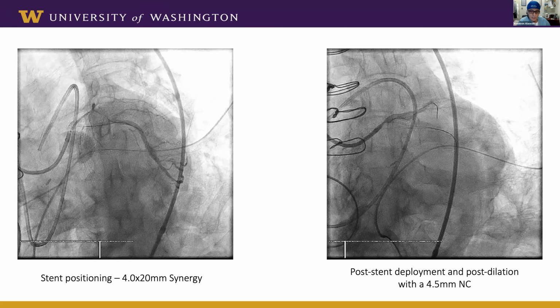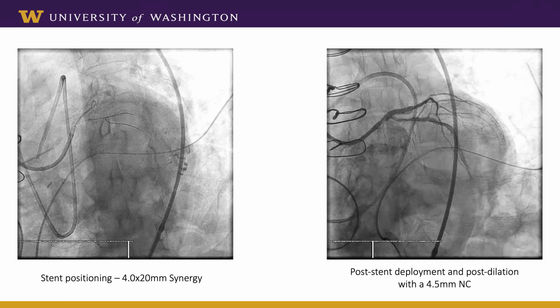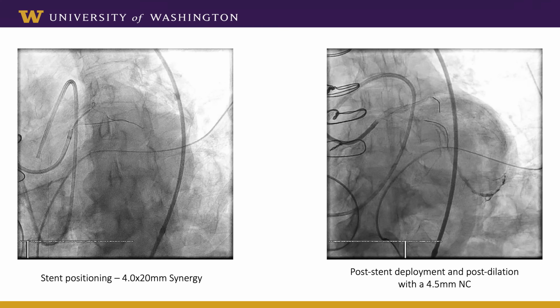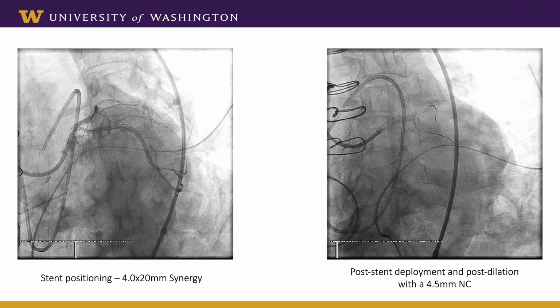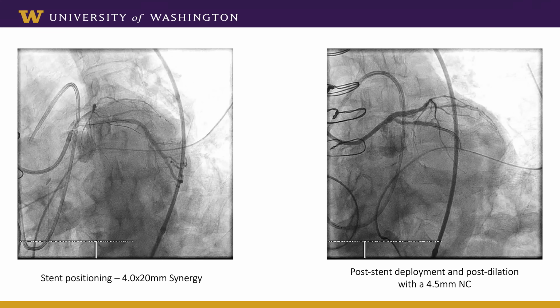How about you, Kate? Yeah, we almost always land them that way. That's probably a trick I learned from you, actually. He had this weird angle of takeoff such that he had terrible overlap in the cranial view, unfortunately. So that almost always saves us.